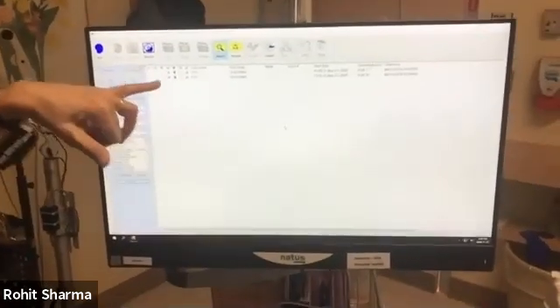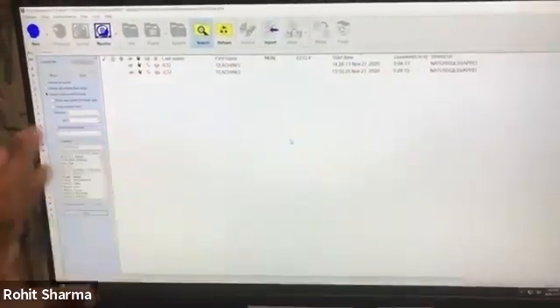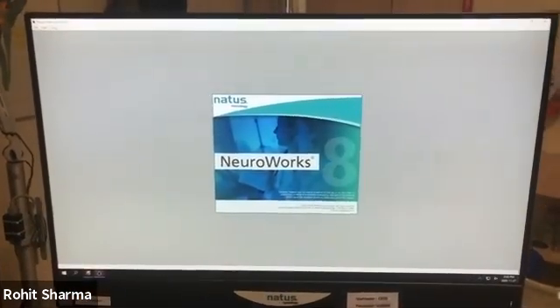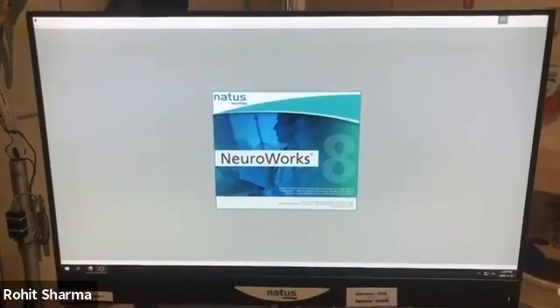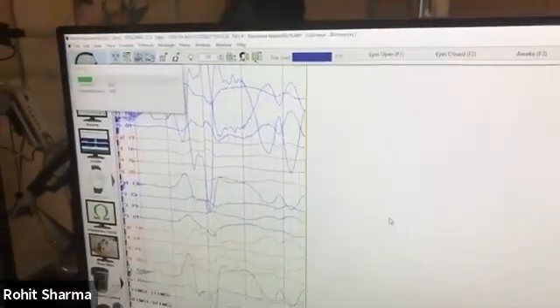If you notice that it brought it back to the ICU teaching that we're doing, it'll bring you back to the patient. This is called the database. This is where all the recording happens. So it'll bring it back to right where you left it, and the patient's name and everything should come up. So just have a double check. And if you notice now, the recording has started on its own.